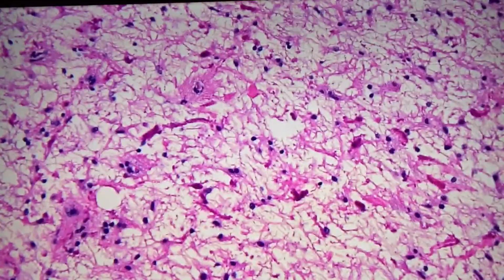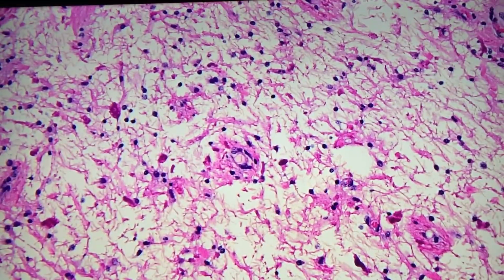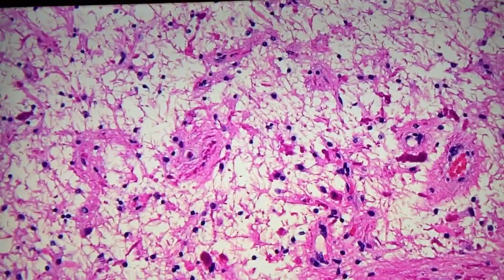So then, just looking at this case, you think, okay, a pilocytic astrocytoma. So where are the neoplastic cells? What is actually neoplastic here? All of these little glial cells are. Very bland looking, isn't it? Yeah, very bland. At least to the untrained eye like me, I'm like, where is the tumor here? They're very bland, not a lot of mitotic activity. Yeah. But this isn't a pilocytic astrocytoma. Oh, it isn't. Okay.